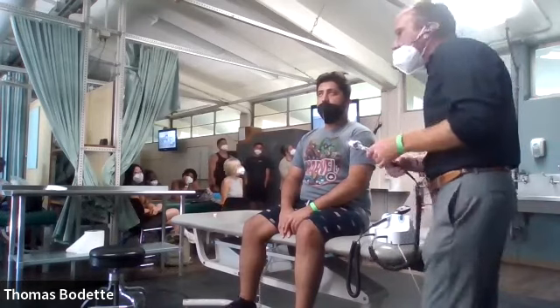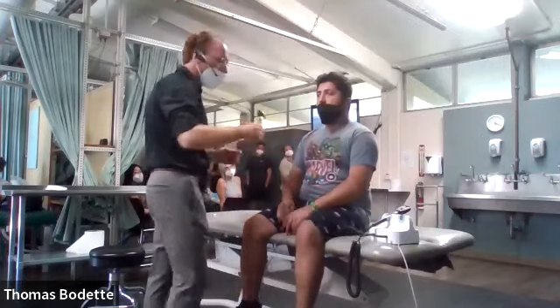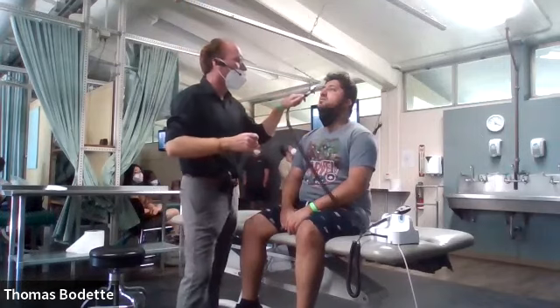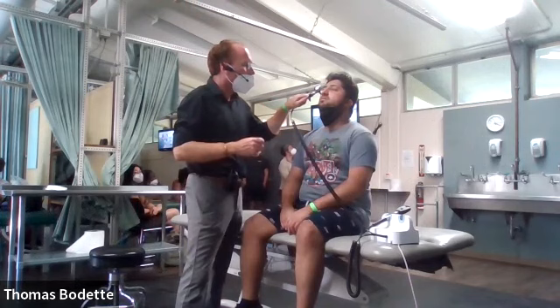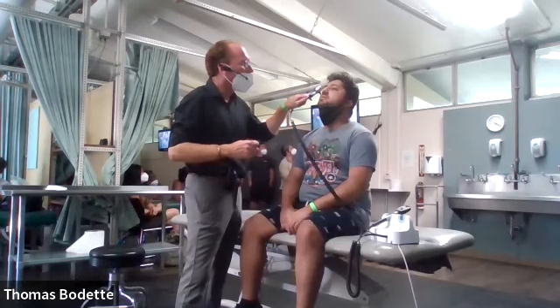Okay, so maxillary is pretty tricky. Here's how it's done. You're going to angle your otoscope speculum, in this case, superior to inferior. And when I tell you, I'd like you to open your mouth. So the first step is to angle the speculum superior to inferior.